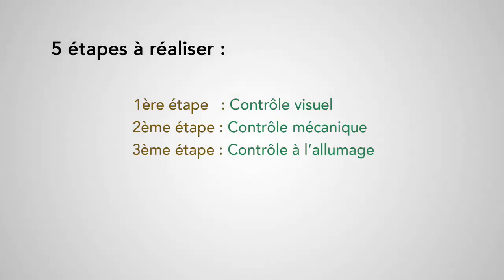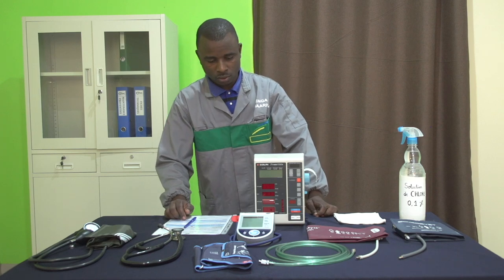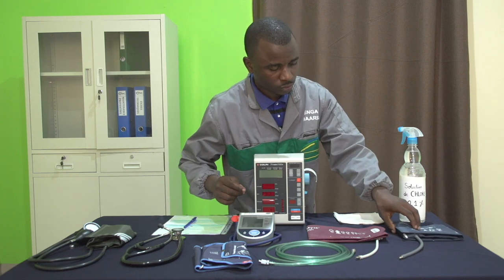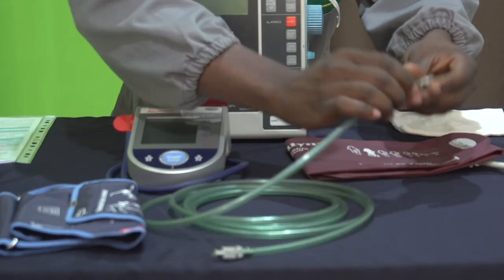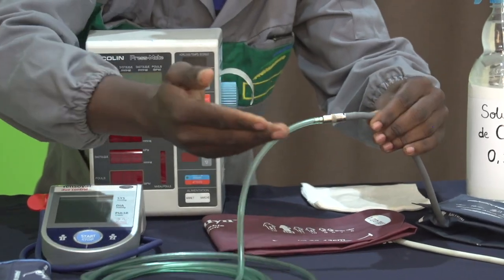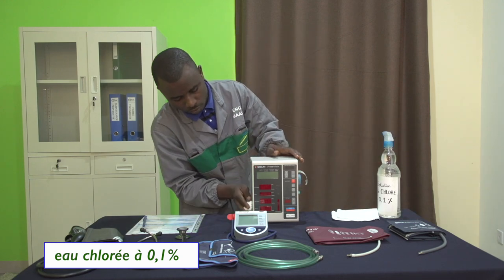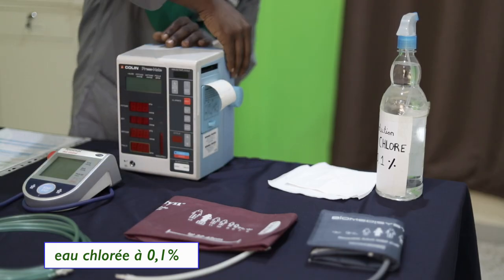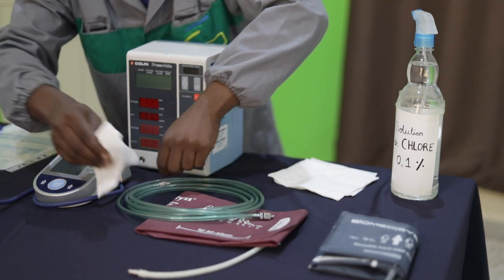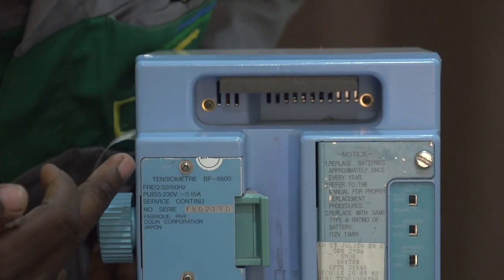Dans la procédure que nous vous proposons, il y a 5 étapes à suivre. Première étape : contrôle visuel. On va vérifier la propreté de l'équipement et la présence de tous les câbles et accessoires, c'est-à-dire l'état général de tous les câbles, des accessoires dont les brassards et leur rallonge, et l'absence de détérioration au niveau des connecteurs. On vérifie également l'existence et la lisibilité des inscriptions externes telles que la marque, le modèle, le numéro d'inventaire et les étiquettes d'avertissement.